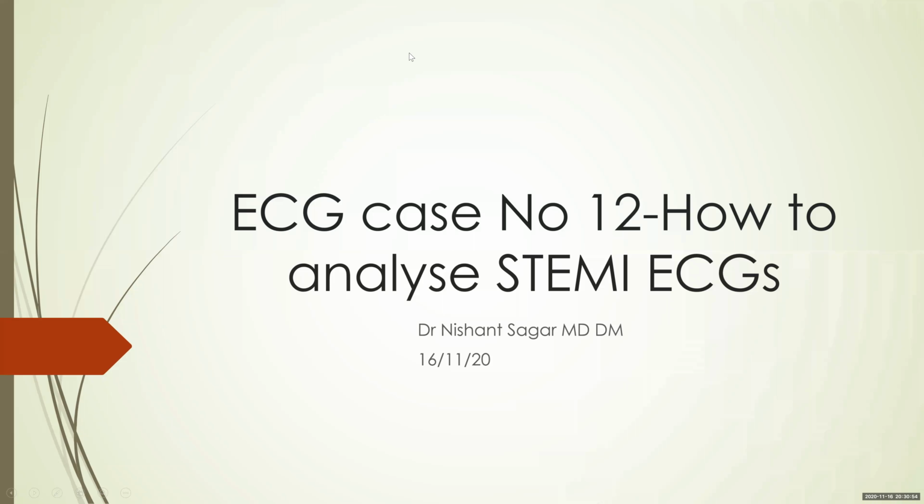Good evening. Today we shall be dealing with ECG case number 12 in our ECG series. The title is How to Analyze STEMI ECGs.